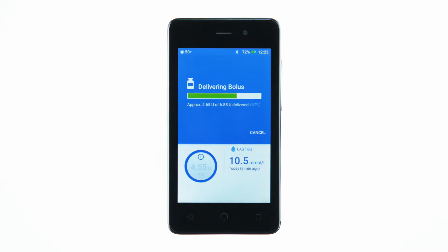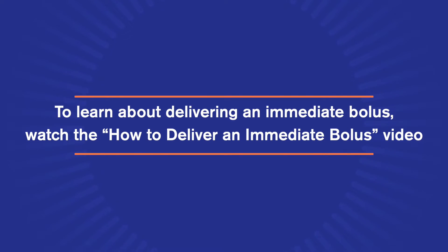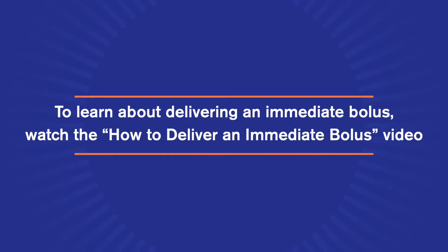The process of delivering an extended bolus is similar to the process of delivering an immediate bolus. To learn about delivering an immediate bolus, watch the 'How to deliver an immediate bolus' video.